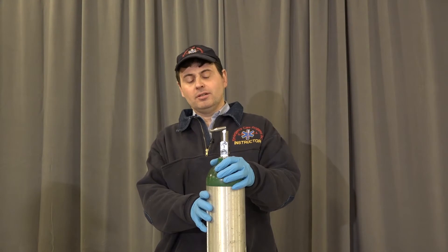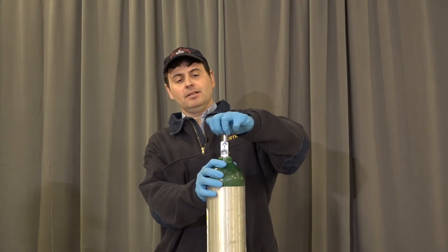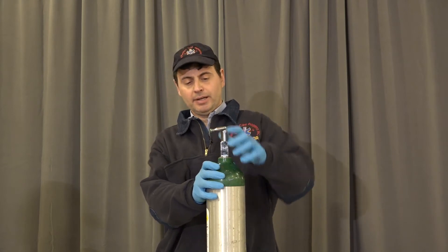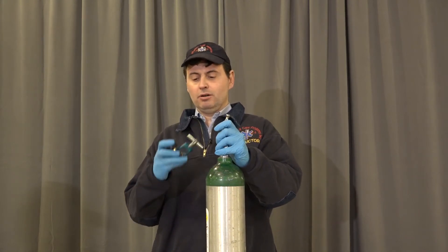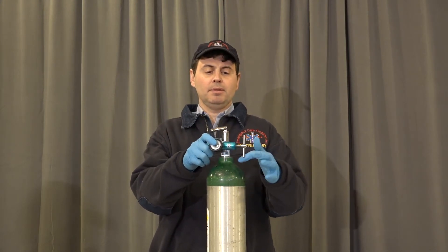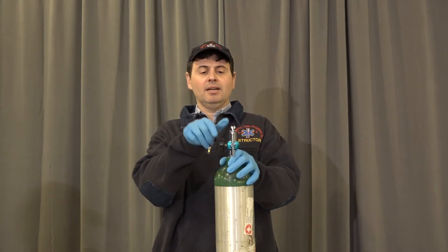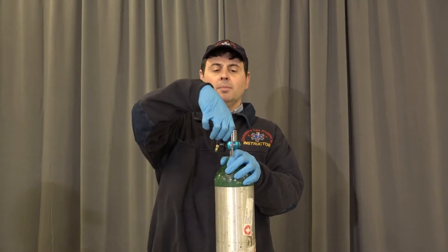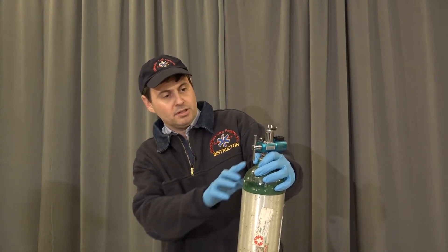As we assemble the oxygen tank, the first thing we're going to do is crack the tank to blow out any dust or debris. We're going to take our regulator, make sure the O-ring is in place, line up the pins in the holes, hand tighten it, and open the valve one complete revolution.